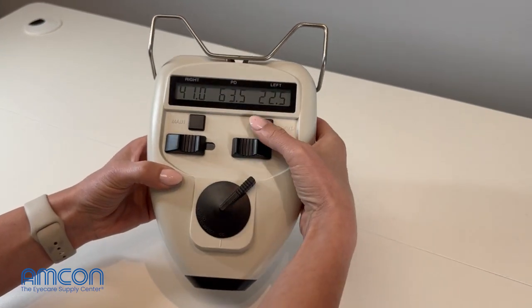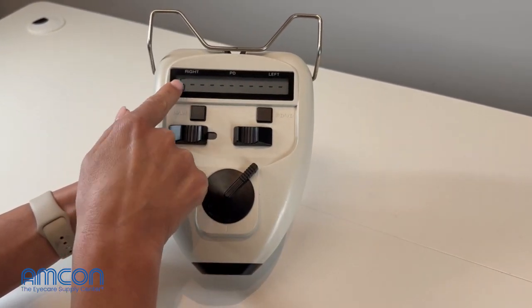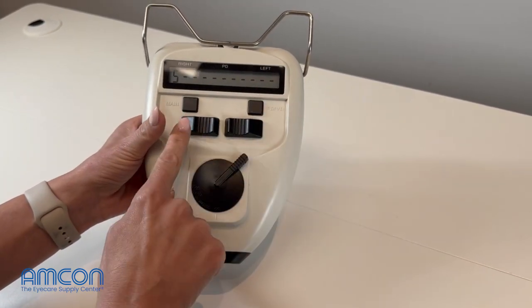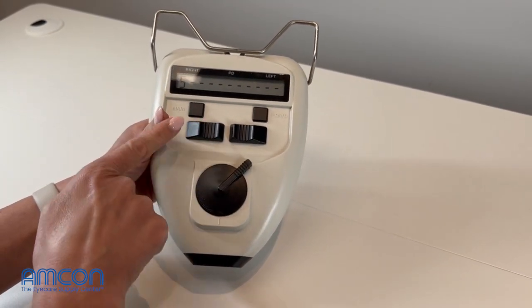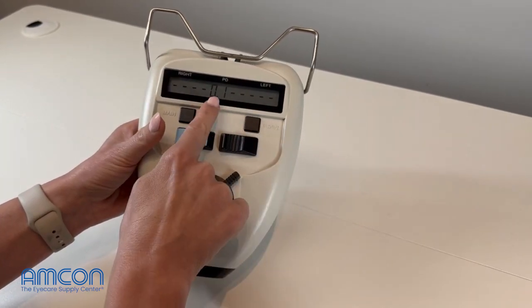Once you get it there, take this button and press it five times pretty quickly. You'll see these numbers here change. Once you get it to five, take your right measure tab, push it back towards nasal, and then press that button again.